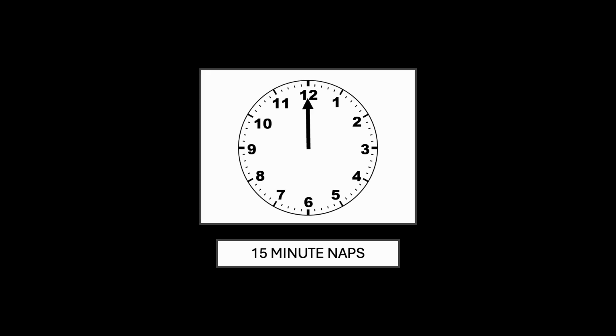A clock takes 60 minutes to go completely all the way around. If you take 15-minute naps and look at the clock every 15 minutes, you'll see the 12, then the 3, then the 6, another 15-minute nap later the 9, and then after another nap it goes to the 12. And so you're able to accurately depict, just from seeing that it went from the 12 to the 3 to the 6 to the 9 and back to the 12 again, that the minute hand is actually going in the right direction.